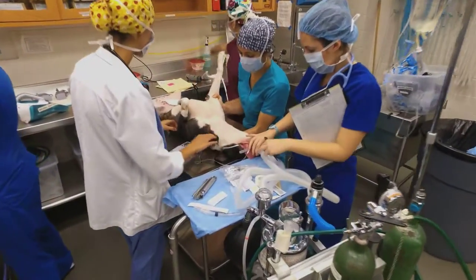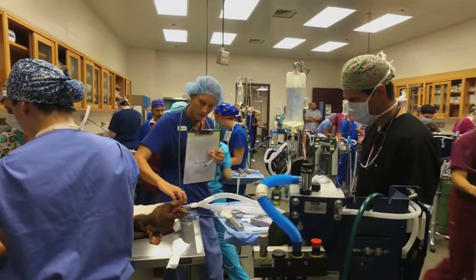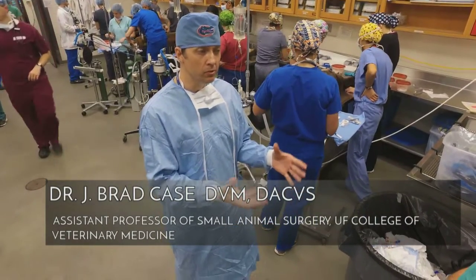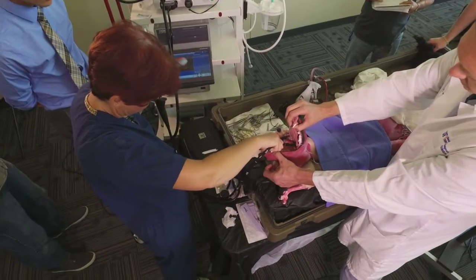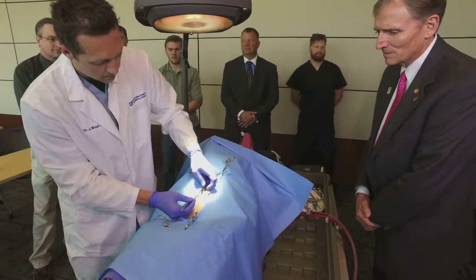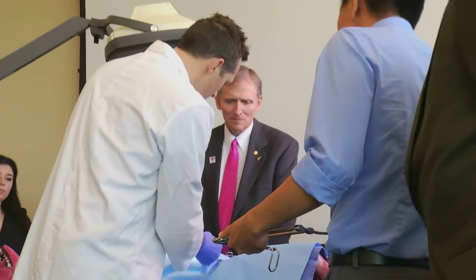This is the sophomore surgery spay-neuter laboratory. These are sophomore veterinary students performing their very first spay or neuter. The Sendaver synthetic tissue is going to be the wave of the future — it's going to allow us to train veterinary students how to do procedures in a very realistic sort of way to better prepare them for the live dog experience in the real world. The Sendaver synthetic canine is going to revolutionize veterinary medical education at the University of Florida, helping us become one of the leading institutions in academic veterinary medicine in the world.